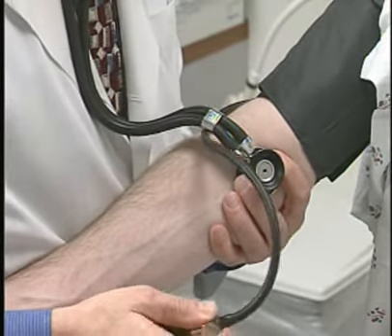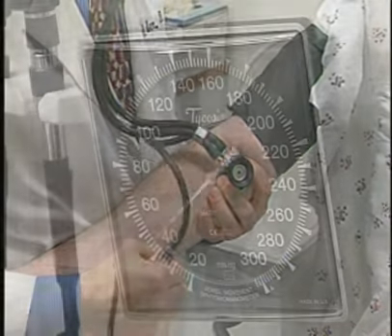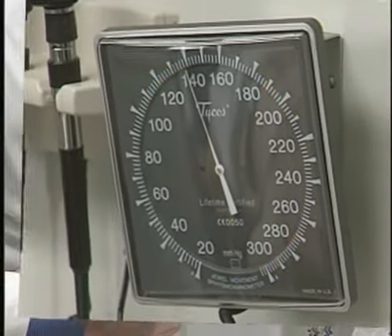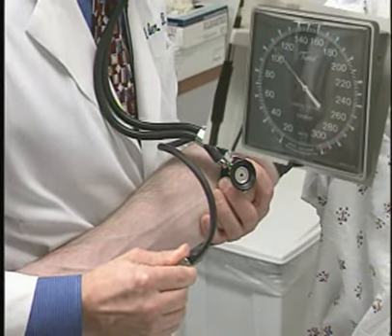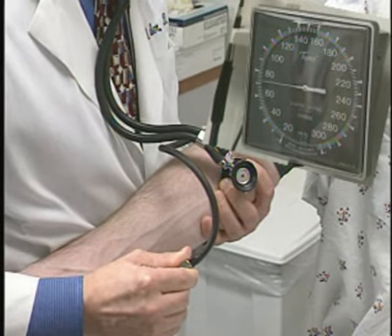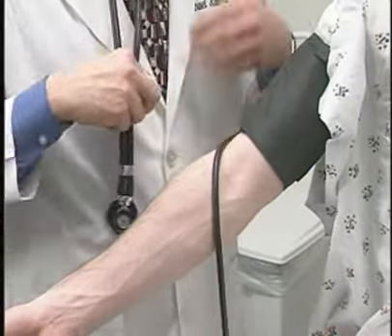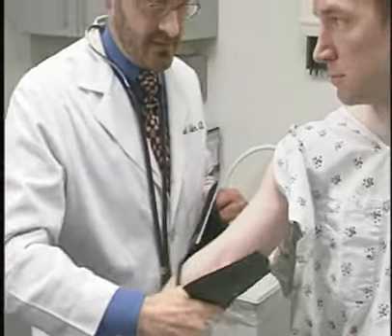So close the cuff and the valve, and then slowly blow it up again, about 20 points again beyond where I felt the blood pressure disappear by palpation. I'm going to slowly release the air. The point at which I first heard the blood pressure pulse return was 116. I heard the pulse disappear at approximately 76. So the blood pressure by auscultation is 116 over 76.